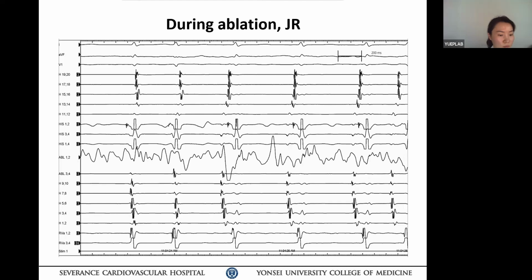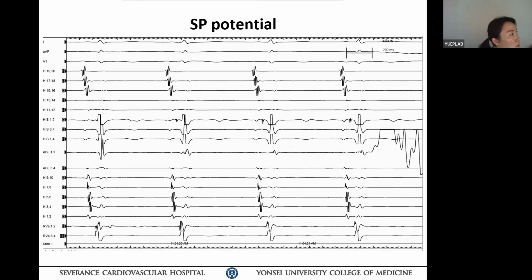It's so difficult. I just want to say one more thing. When you are presenting the ablation, before the ablation signal, it's better to capture it at a higher sweep speed, with well-delineated local and far-field potentials of the ablation distal catheter. So yeah, that's all.